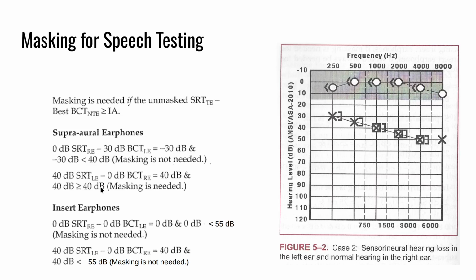So we do need a mask for SRT in the left ear.